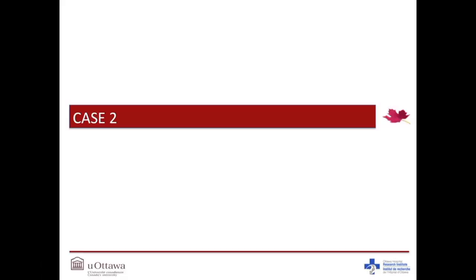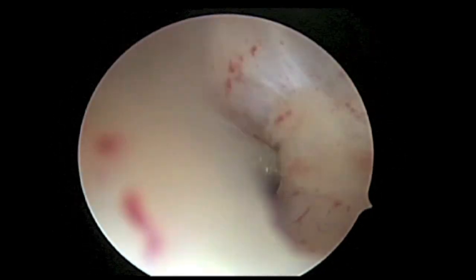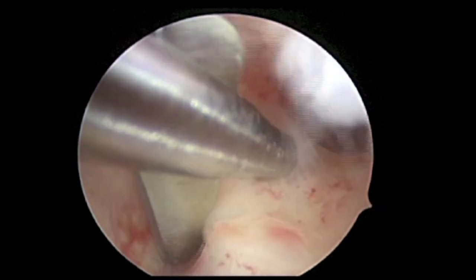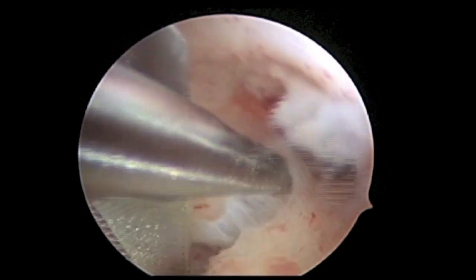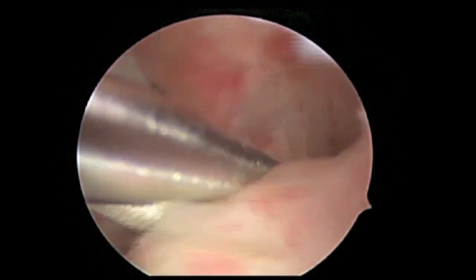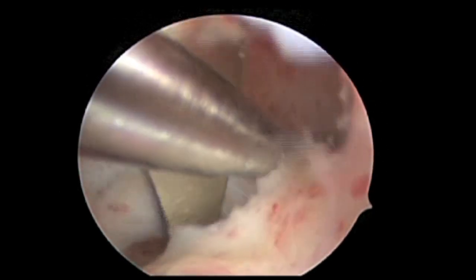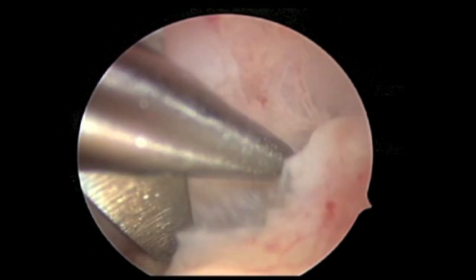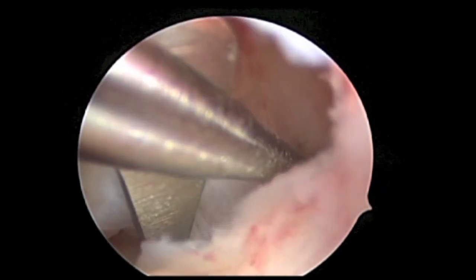Our second patient also presents with a similar history of postpartum curettage and subsequent amenorrhea. Diagnostic hysteroscopy reveals thicker adhesions in this case in the mid-uterus, resembling a uterine septum. The micro scissors are used to release these densifications. Pushing and spreading can also be performed using the scissors, as long as one is very cognizant of their location in the uterine cavity. Note that the adhesions are largely avascular and bleeding is not seen. The gentle flow of saline allows the cavity to open up as the adhesions are released.